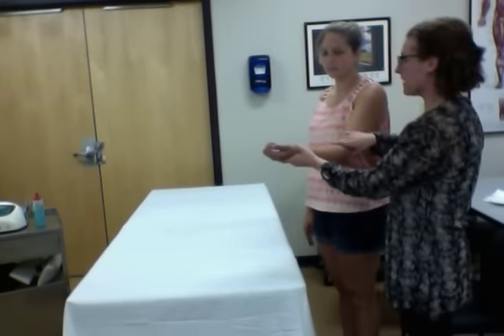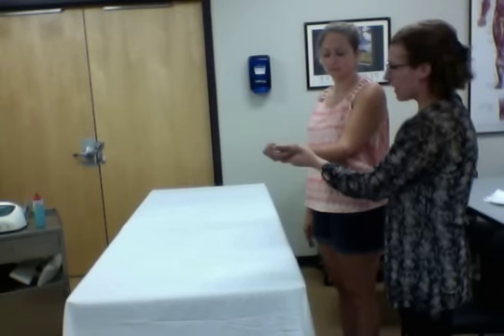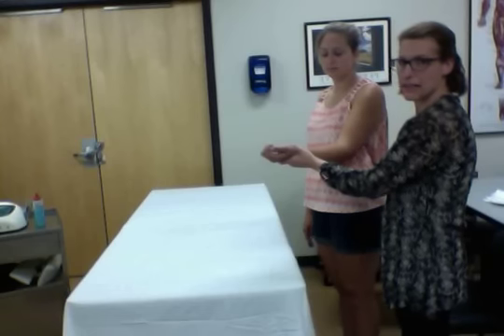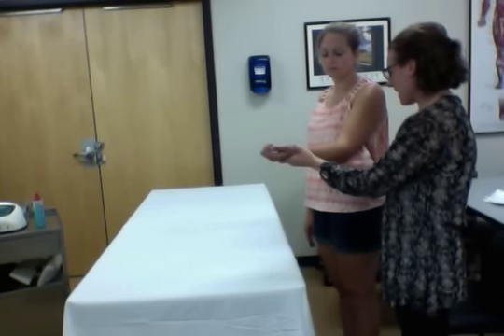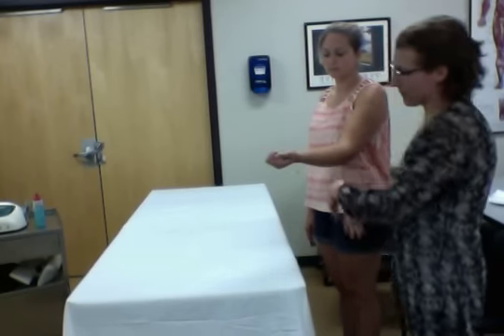Currently, there's no redness, swelling, or warmth in the area. It's not painful except for stretch being sensed on the anterior part of the elbow. And so today we're going to do some treatment on his elbow. So we'll rewind and let's say that we just met.